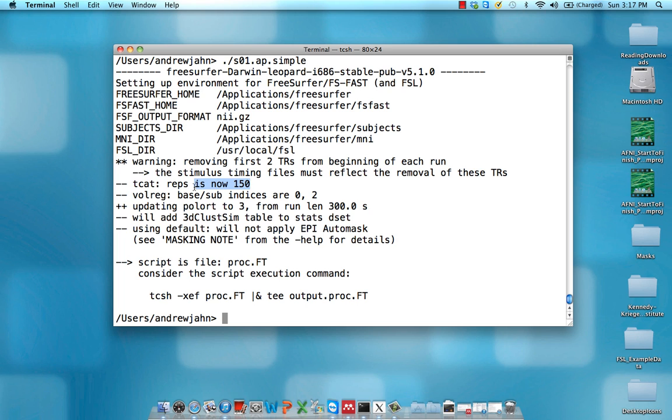TCAT, the number of repetitions is now 150. Each functional data set had 152 TRs or volumes within them. Now they have 150.